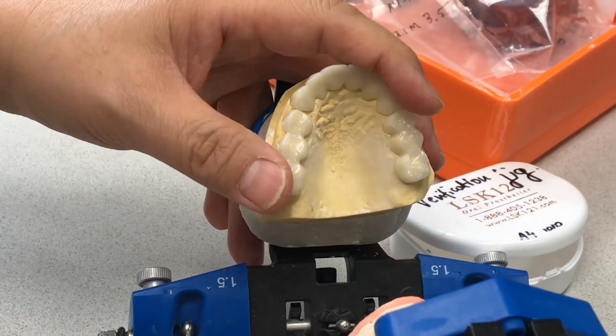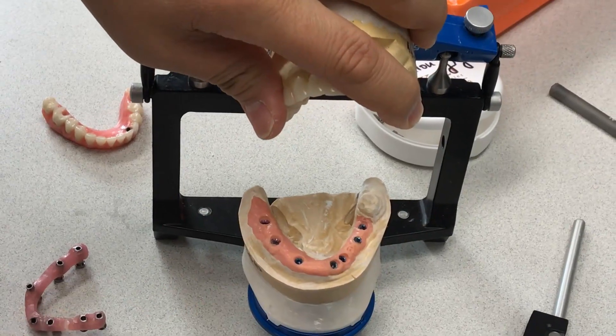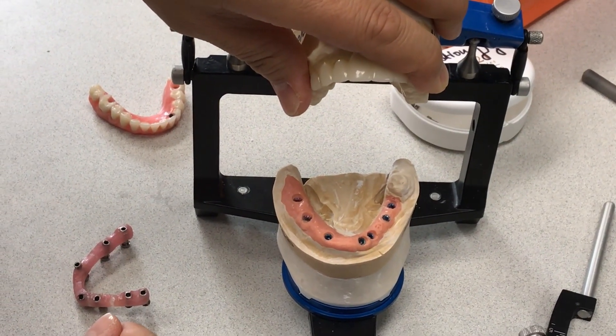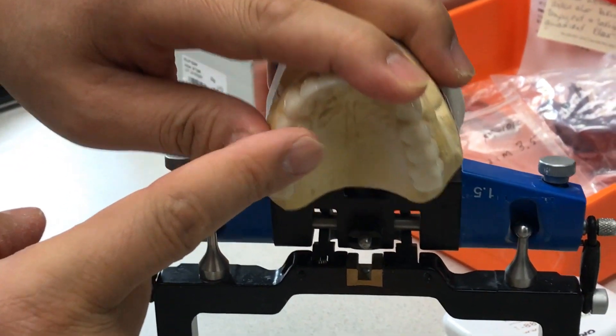Anyway, this is another great restorations combo case — lower seven-unit implant and top fixed restoration is coming soon after we send it out to the doctor's office. Thank you.